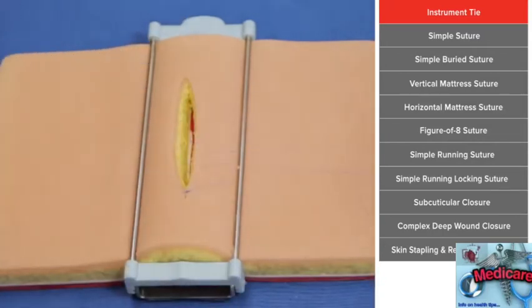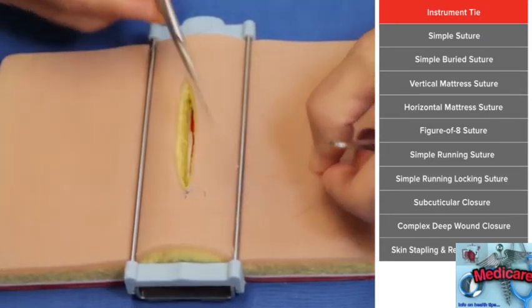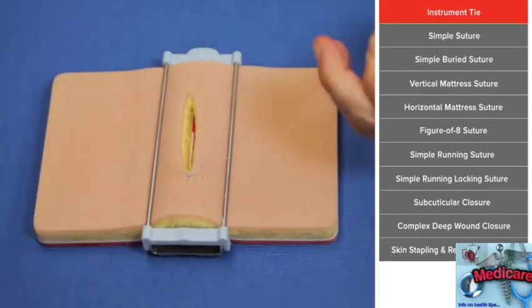So you're doing the same thing every time. The first time you're wrapping it twice, and that's called the surgeon's knot, and that'll lock it in place, because what you don't want is you don't want the knot to be loose, you want your skin well approximated. So we call that an air knot when it's not approximated.